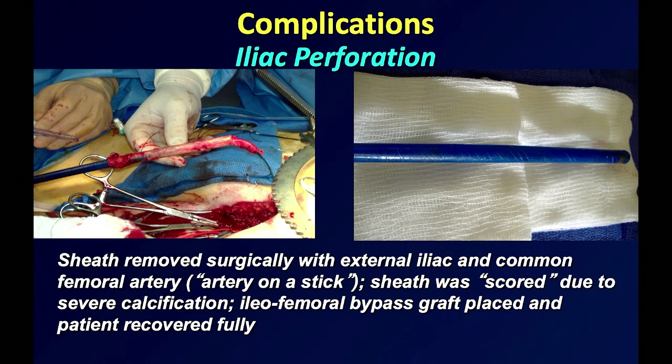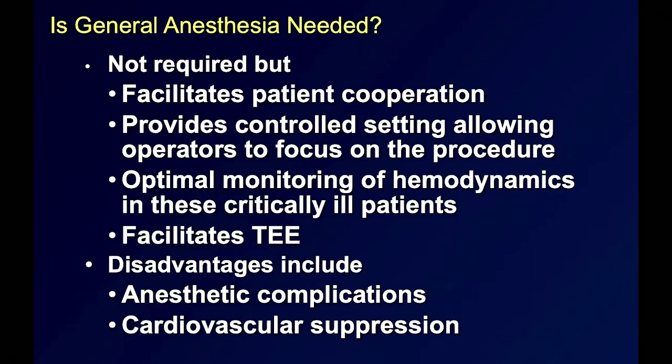And I was proctoring, and I told them to be careful while removing the sheath, because just like a radial, you might have seen radial spasms, when sometimes the catheter doesn't come. What do you do? You take your time, millimeter by millimeter, and pull it back. If you pull back suddenly, this is what happens. The radial artery can also come out with a catheter. Here it's an iliac artery. With a radial artery, patients will survive. Here the patient will die right away because they bleed to death and there's no way to stent anything. Surgery actually can save them.